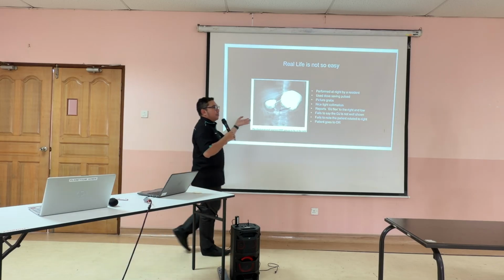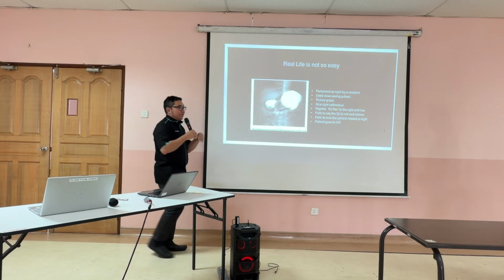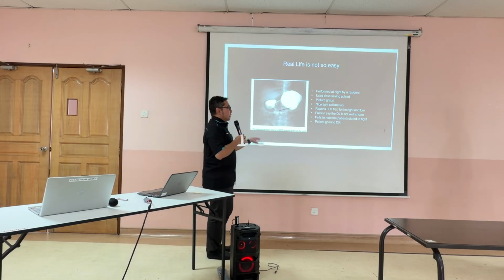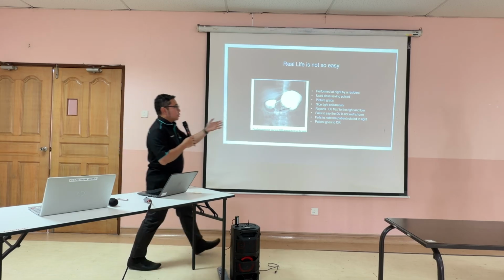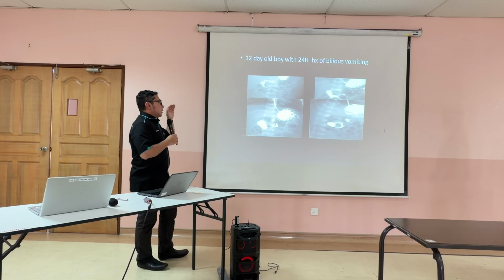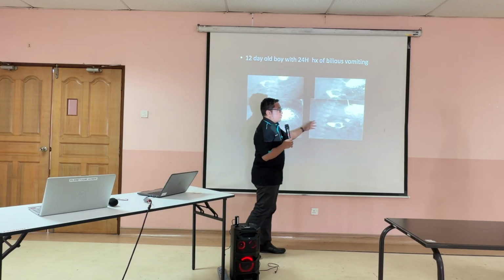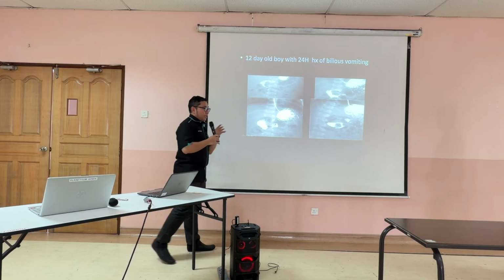It is performed by my medical officer. Because I'm the only pediatric radiologist, I'm on call every day. So they just grab these images without coordination, and they turn out to be abnormal. So patients go to OT. The same goes for this patient. It's very rotated, so you don't know whether the DJ position is abnormal or normal.